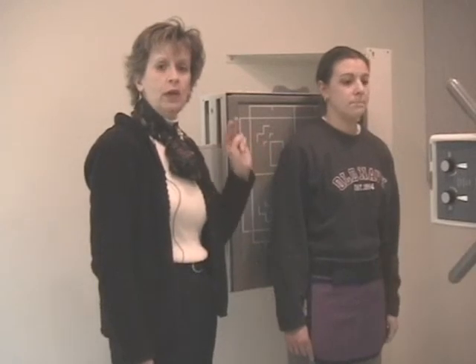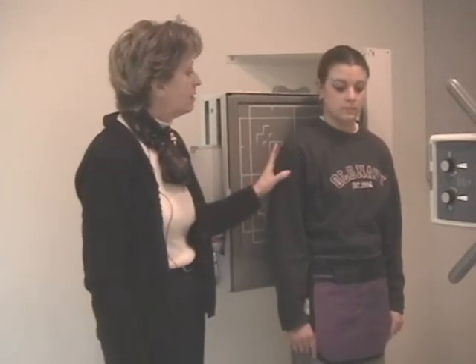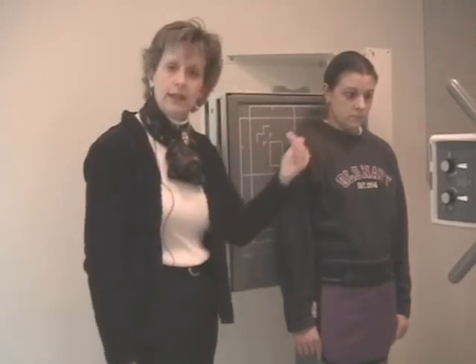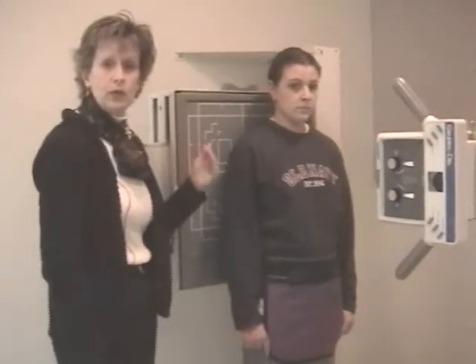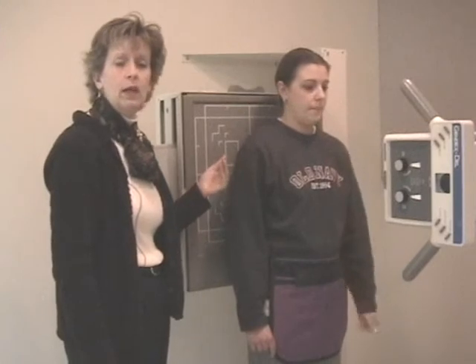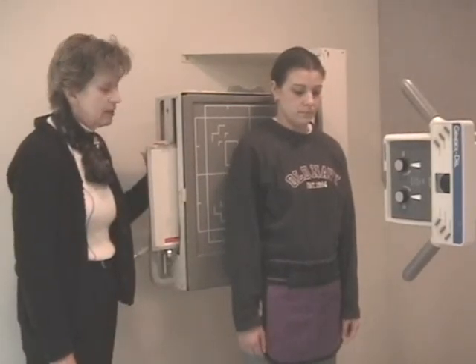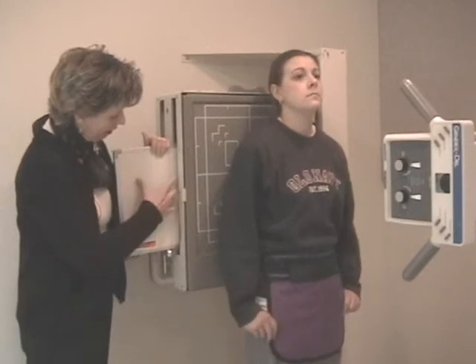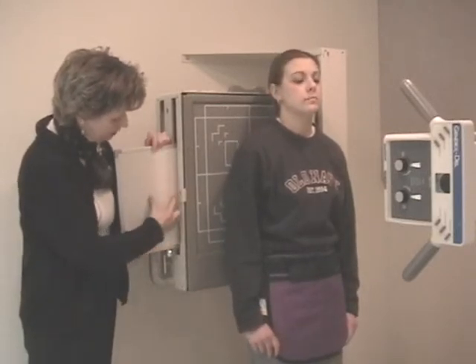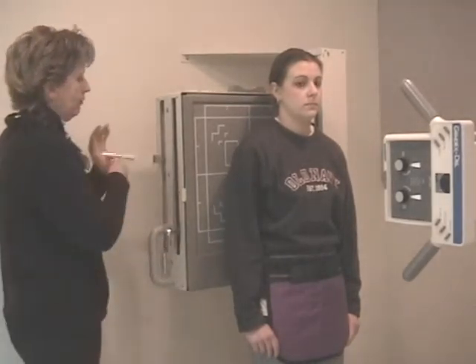Scapula exam is two positions: AP projection and a lateral position. We're going to do a right arm again because it's easier for the camera to see. I have 40 inches SID, using the vertical bucky again — it tends to be easier on the patient. If you were to do this recumbent on the table or stretcher, the centering reference lines will be the same. We have a 10 by 12 because of the shape of the scapula — it's a V shape — and I'm putting the ID to the bottom because of that triangle shape. The scapula is wider at the top and comes down to the narrow point at the inferior angle. So: 10 by 12 lengthwise on the vertical board.